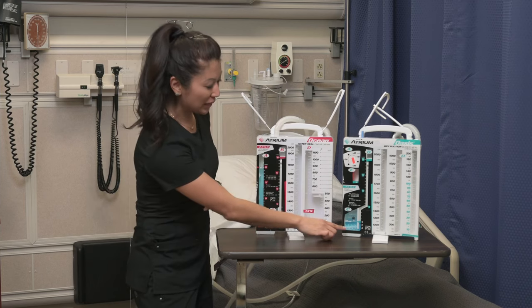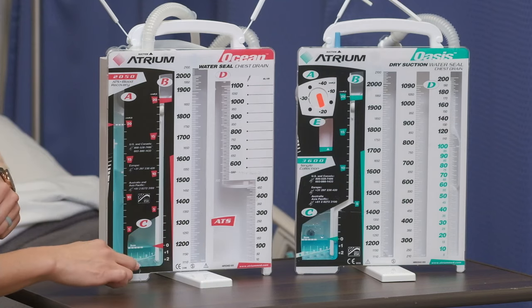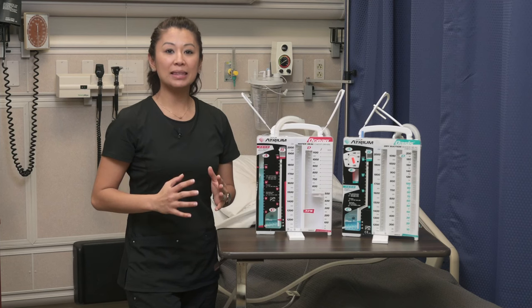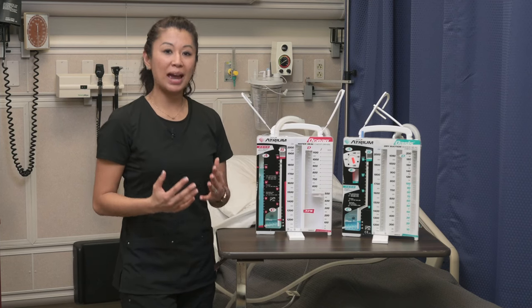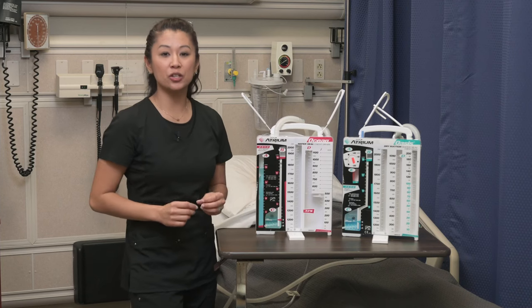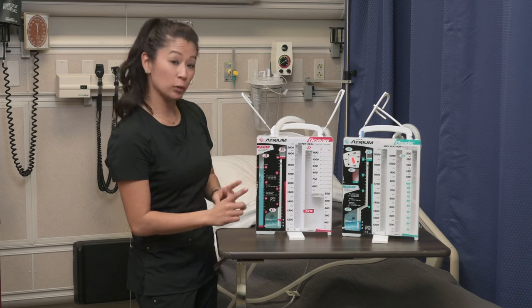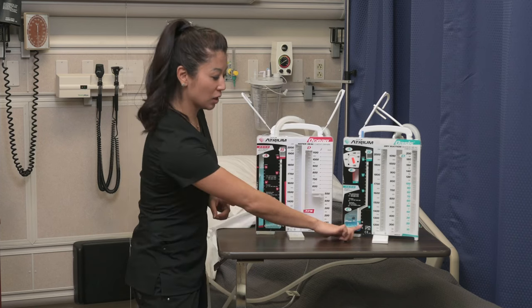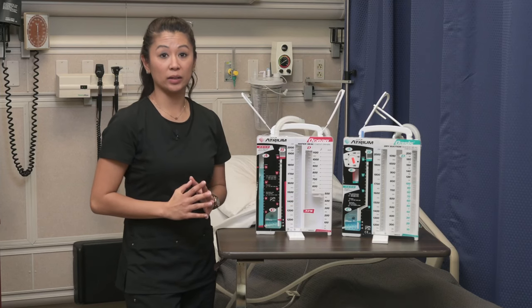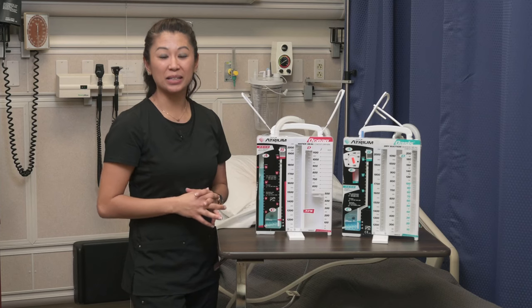Looking at the air leak monitor on both dry and wet, they look exactly the same. When setting up the equipment, make sure the air leak monitor is filled to that two-dotted line. Remember, we go from this side to five — the higher the number, the worse the air leak — so keep an eye on those.